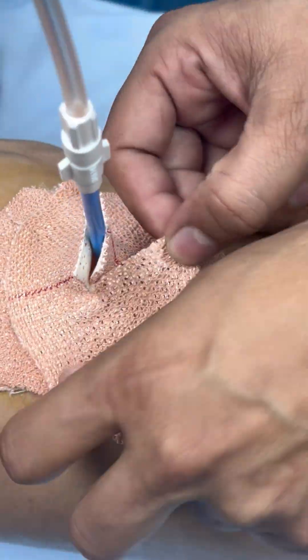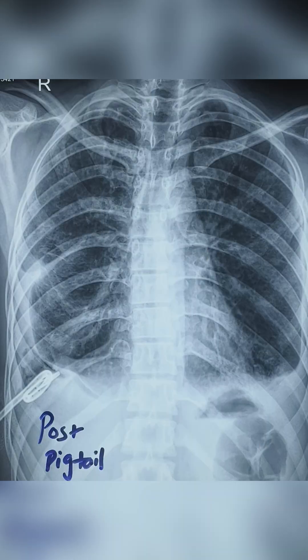We will check our ICD back — the ICD is functioning well. This is the post-pigtail X-ray. Thank you.